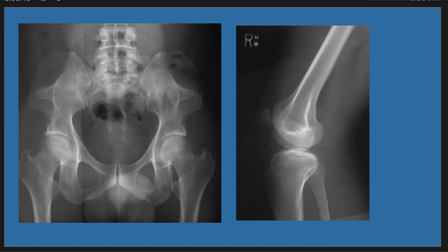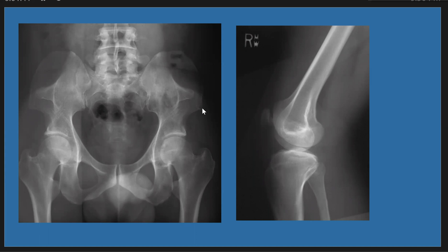Let us start with the pelvic X-ray, the AP view of the pelvis. As we see here in the pelvis, we have iliac horns bilaterally. These are posterior iliac horns seen in the pelvic X-ray. And also in the right knee joint, we see the patella is smaller in size. And also in the pelvis, we see flared iliac crest with a protuberance of the anterior iliac spines.